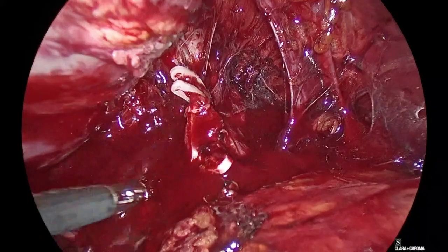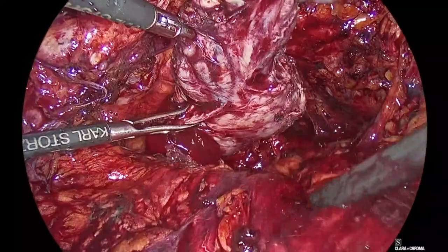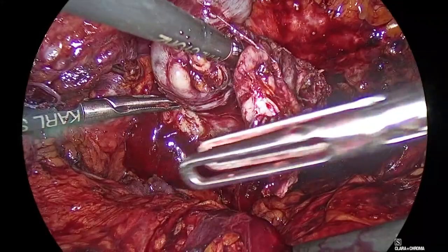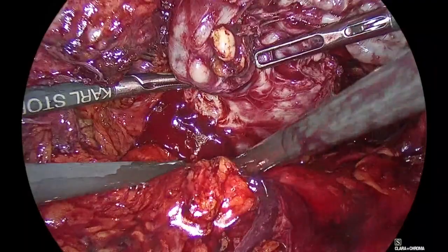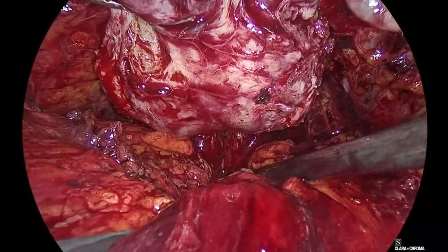Pull the prostate to you. To you. Good. Good. Let's go in. Grasp it from here, Mayade. Big seminal vesicles, huh? Good. Pull it out. Good. Aspirate this clot from here also. Now we're going to move the bowel at the level of the apex. Rotate, Padeli, to the right. To the right. Yes. Good. Mayade, here. Here. Come in. Good.